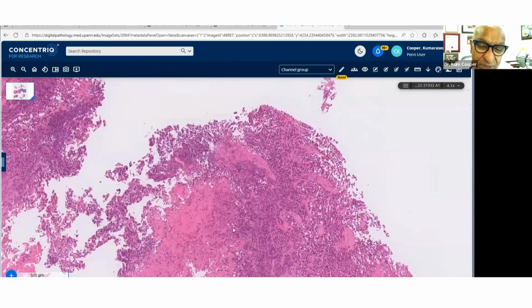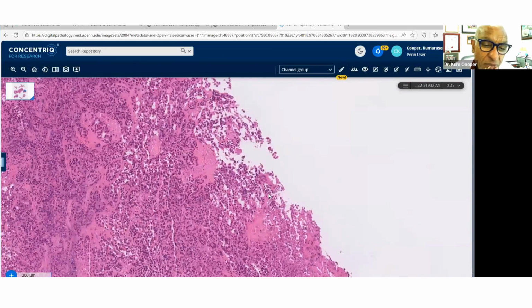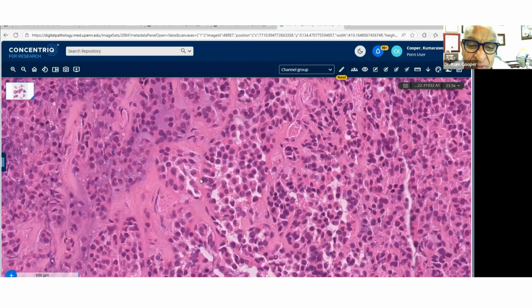So okay, we'll keep that in mind, and then we will resort to meningioma markers, and EMA is a good marker for that, and of course PR, progesterone receptor, and then of course SSTR. SSTR is probably the most useful these days. We've got plasma cell neoplasm, again, because of the color of the cytoplasm.